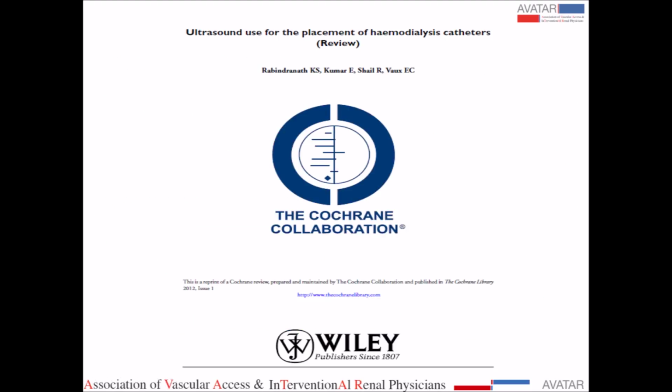And all these guidelines are based on this Cochrane meta-analysis, which was published in 2012, and earlier also it was published, and this is the basis of most of the guidelines. What this review has done is select all the randomized trials which have randomized patients into ultrasound guided versus landmark technique insertion, compared the complication rates and come up with a meta-analysis, and this is the basis of all the guidelines.